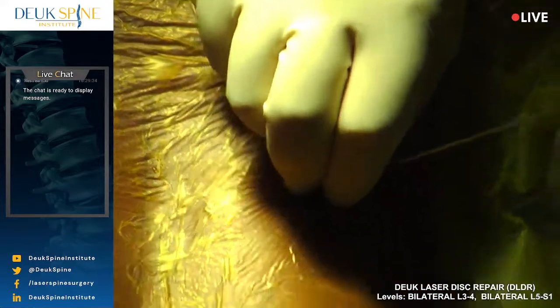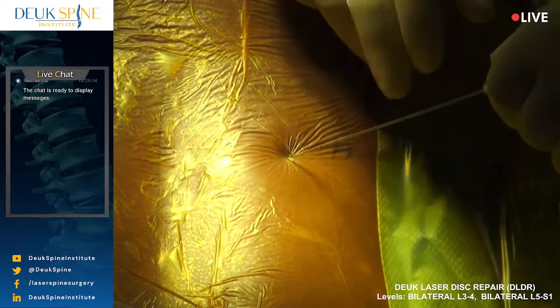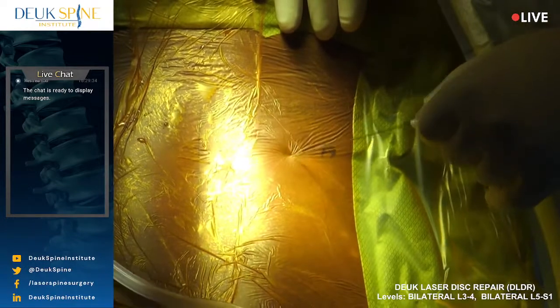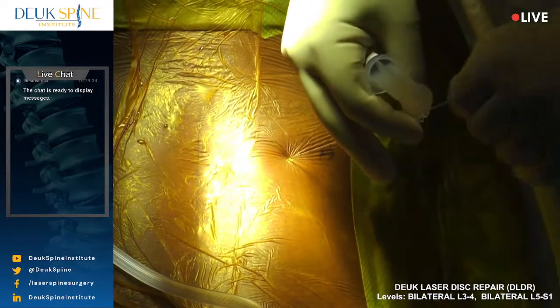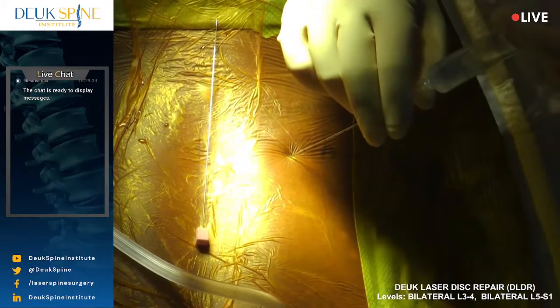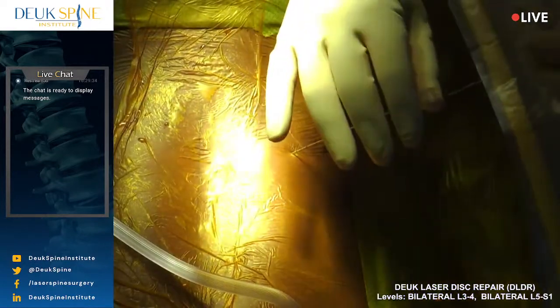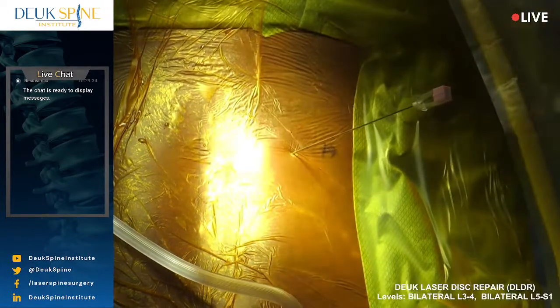Remember, try not to move, okay? All right. If you feel pain, just say ouch, and I'll give you some more numbing medicine. So we're going to start on the left side. Numbing. Now, while we're doing the surgery, I'll be talking to my team as well as you, okay? And we're going to put you to sleep soon, but not yet. It's going to be about 10 minutes, maybe 15. Okay, I just gave you some more numbing medicine. That should start feeling better in a few minutes. So, just bear with me.